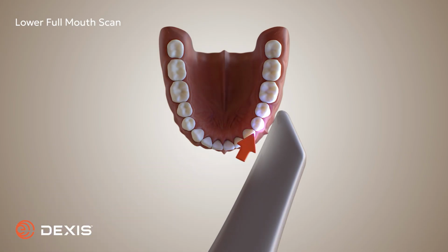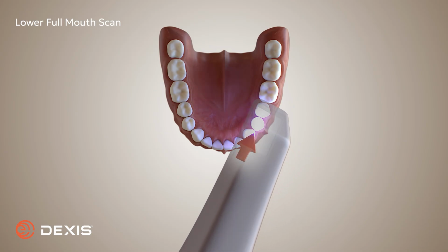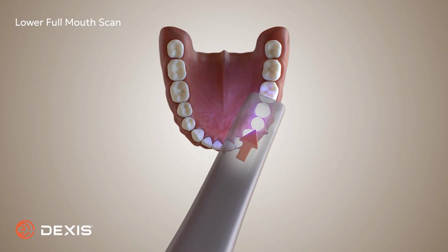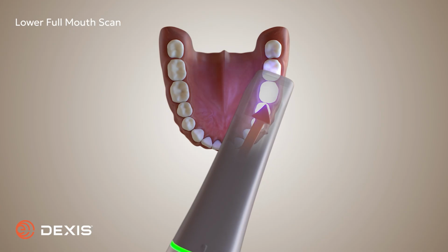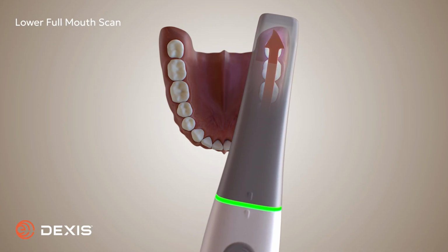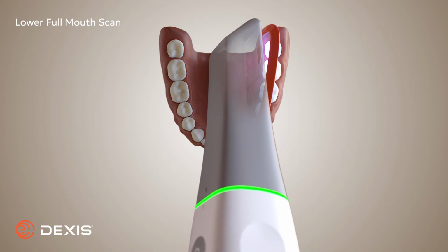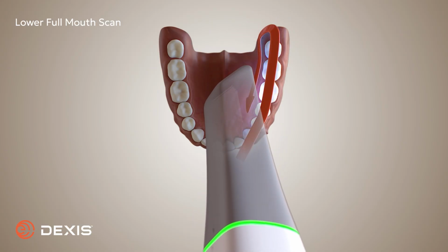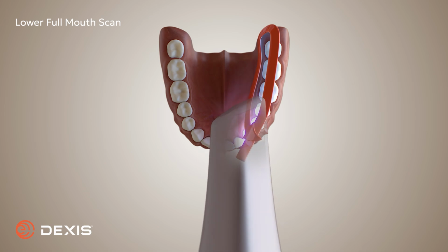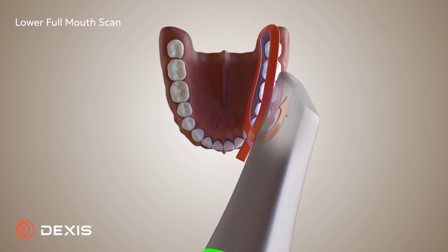Now complete the remaining posterior region. Begin at the first premolar, resting the scanner on the occlusal surface. Scan from the premolar to the last molar, maintaining light contact. Rotate the scanner 45 degrees lingually and scan back toward the canine. Then glide over the cusp tip of the canine and scan the buccal surfaces from canine to the last molar.